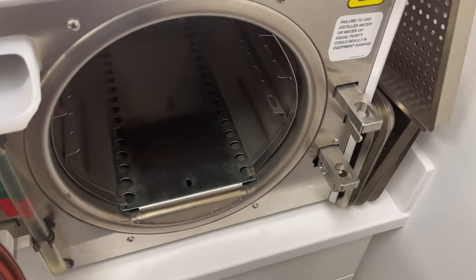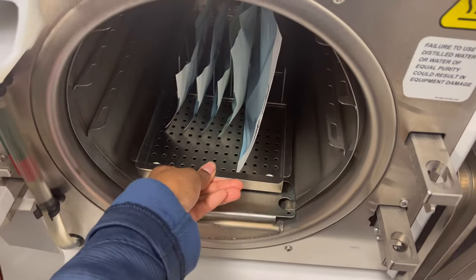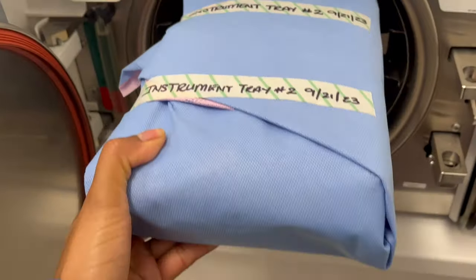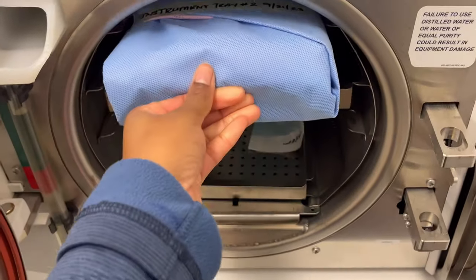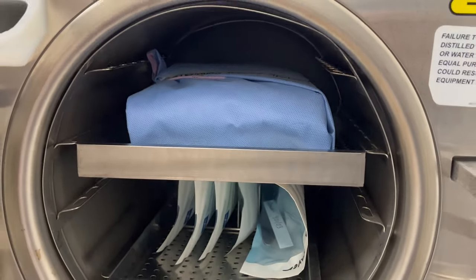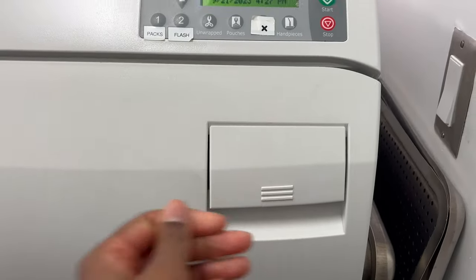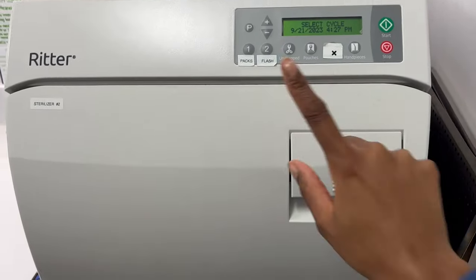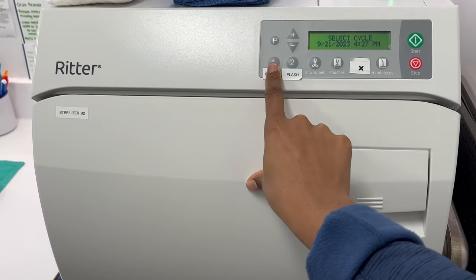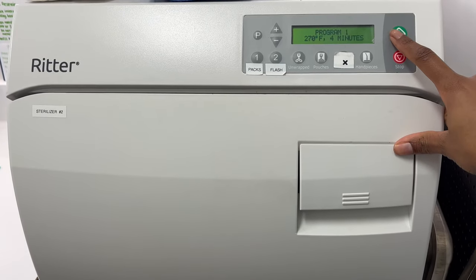So this is the autoclave, a standard autoclave. I'm going to go in and place my rack on the bottom. And then you can also go ahead and put a pack on top of that as well on its own tray. So when you're doing that where you have pouches and then a pack, you always, always want to select packs. Never just pouches, because obviously packs have a longer sterilization time that they go up to. So you want to always just select packs on there and then just hit start.